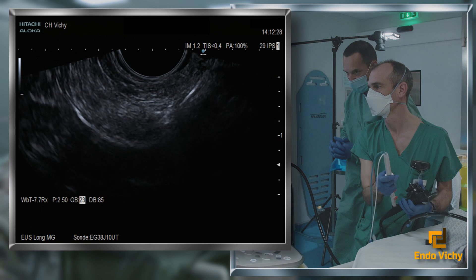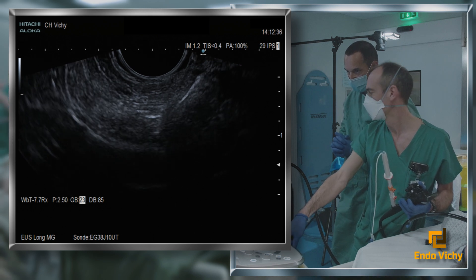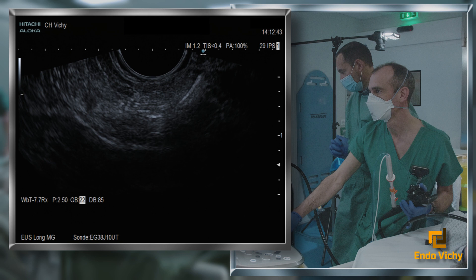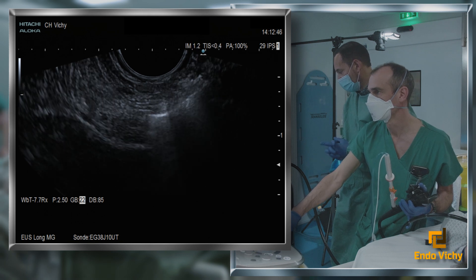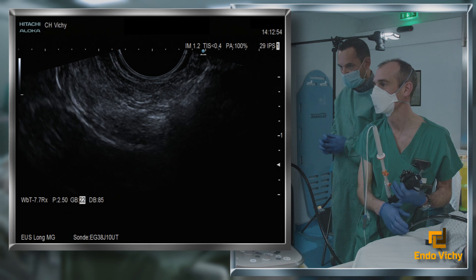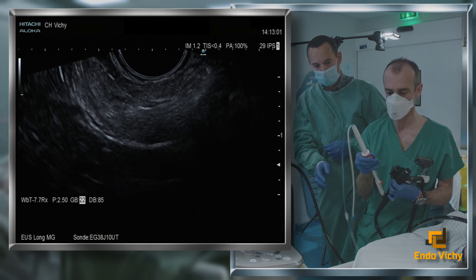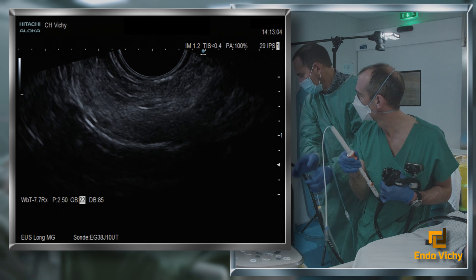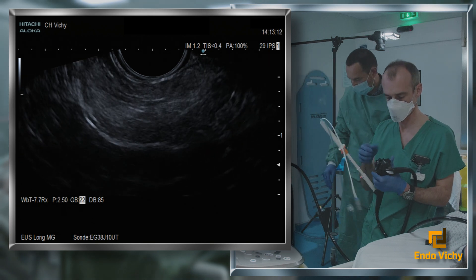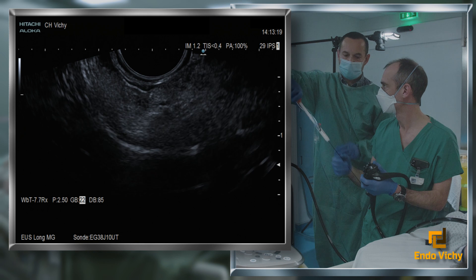You can inject Sonovue contrast agent at the end of the examination, though not used in this case. The patient presented with light acute pancreatitis delayed for more than 24 hours, probably favored by the proximity to the MPD duct and the small size of the lesion.